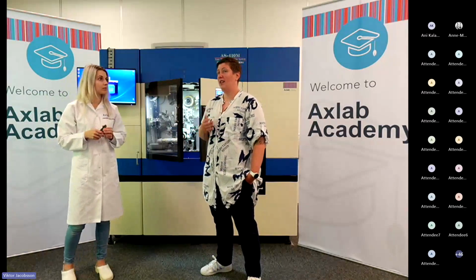How long does maintenance take? Oh, actually not that long. I think it varies, of course, on how long the technologist has been on the instrument, if it's a trainee or something like that. But we use for 2 instruments around half an hour in the morning, and then there will be a little maintenance between the runs where we just check that everything is as it should be.